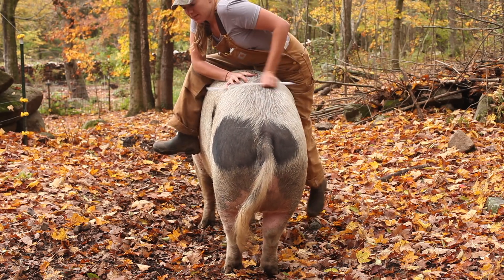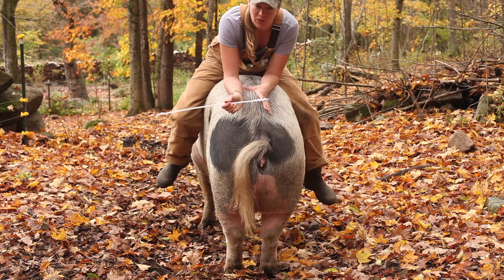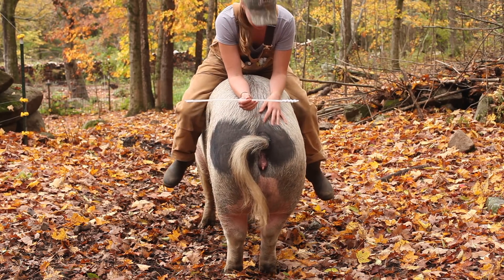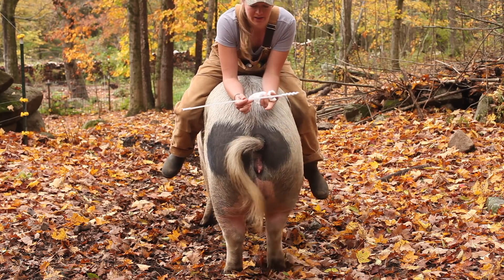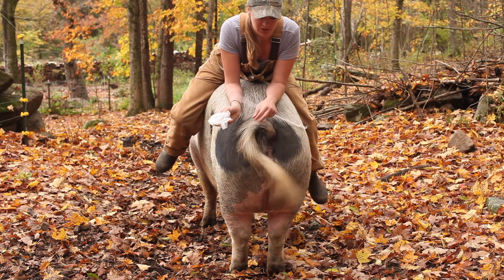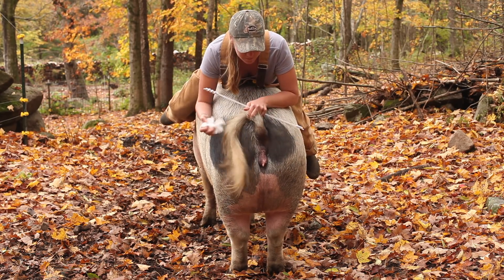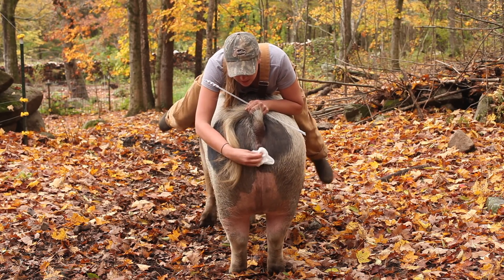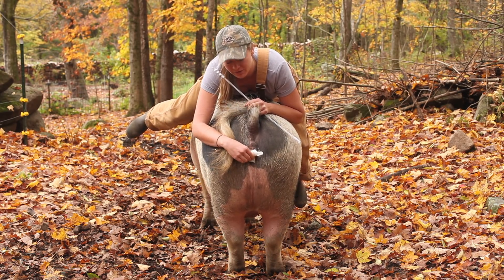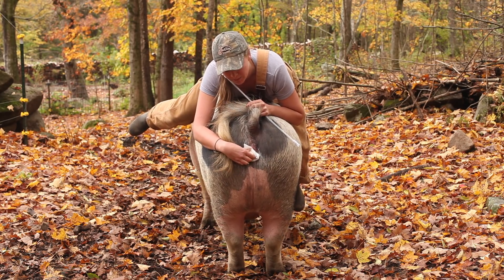So first things first, I got to get on her. Some pigs you can breed from the ground because they stand without the simulation, but right now I am simulating a boar, which is stimulating her to really stand and lock in. First things first, you have to clean the area. You certainly don't want to let any outside bacteria or contaminants get in her. So I'm going to lift up her tail. Because she's so tall she makes this a little difficult — I really have to lean over here. Just give her a good cleaning, and you can see that she is arching her back, which means she's ready. Make sure it's nice and clean.